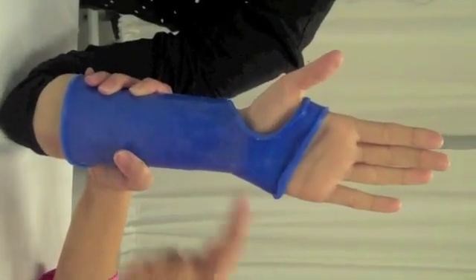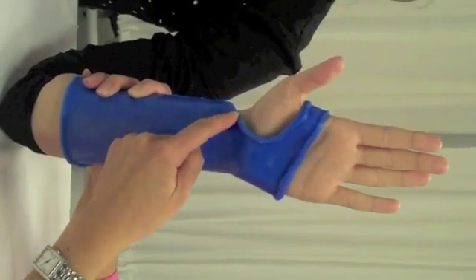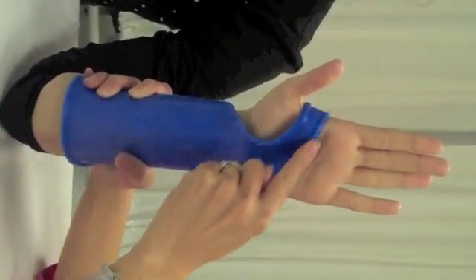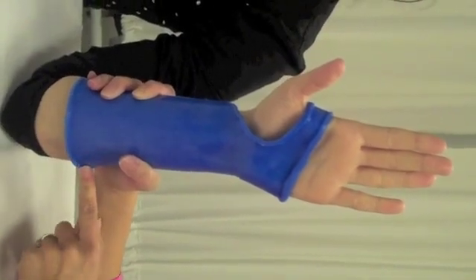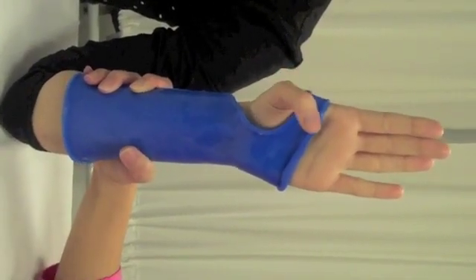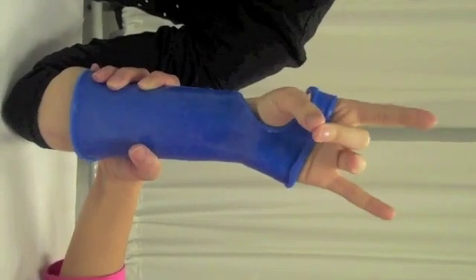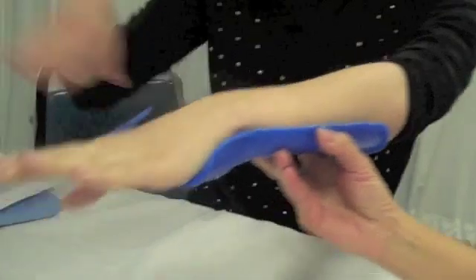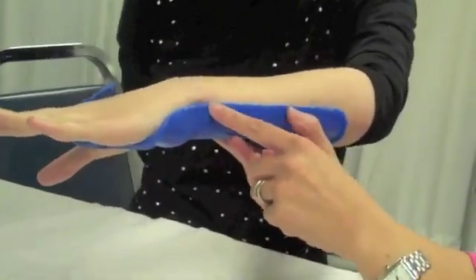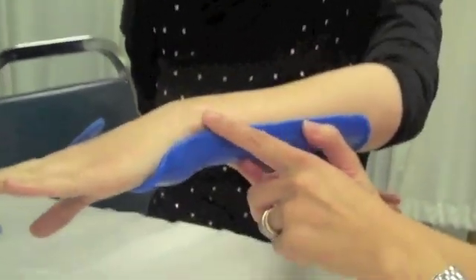Once the splint is fabricated, make sure that it clears the thenar eminence and the distal palm or crease. Make sure that the bottom of the splint is flared to ensure patient comfort. Instruct the patient to oppose all digits and then make sure that they can make a straight fist. Make sure that the forearm trough clears the ulnar styloid process.